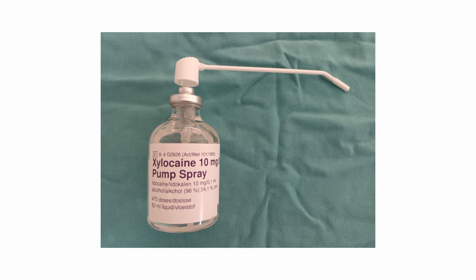So the purpose of this talk is not to make you an expert on this, but just to give you an overview of how it is possible to do awake video laryngoscope guided endotracheal intubation. So just for completeness sake, if you are going to be applying lignocaine to the airway as a topicalization to achieve anesthesia of the airway, the maximum safe dose is 9 milligrams per kilogram. And so while you are doing this approach, you have to remember how much lignocaine you have used.